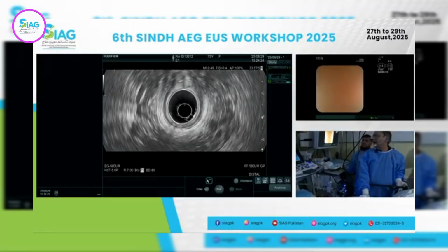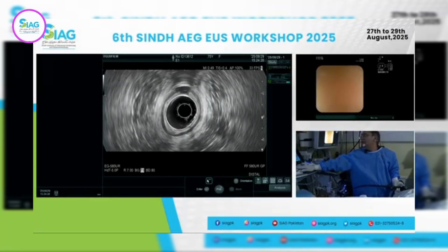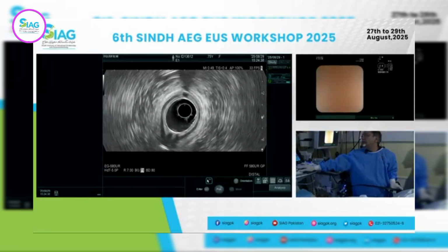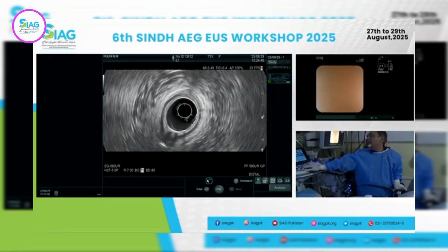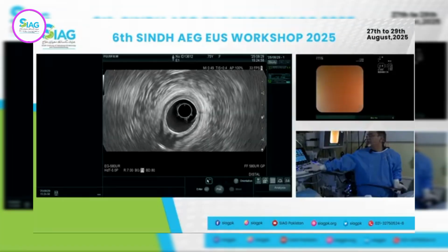Sometimes in fecal incontinence, you might see a break in the muscle, and usually that break is going to be in females who have given childbirth. It may be a breakage on the anterior side, especially in those forceps assisted deliveries. Sometimes there could be a breakage in the internal sphincter on the top, and an episiotomy could also lead to some breakage. That would look like not a continuity of the muscle, but like a fibrous strand there and a breakage in the muscle.